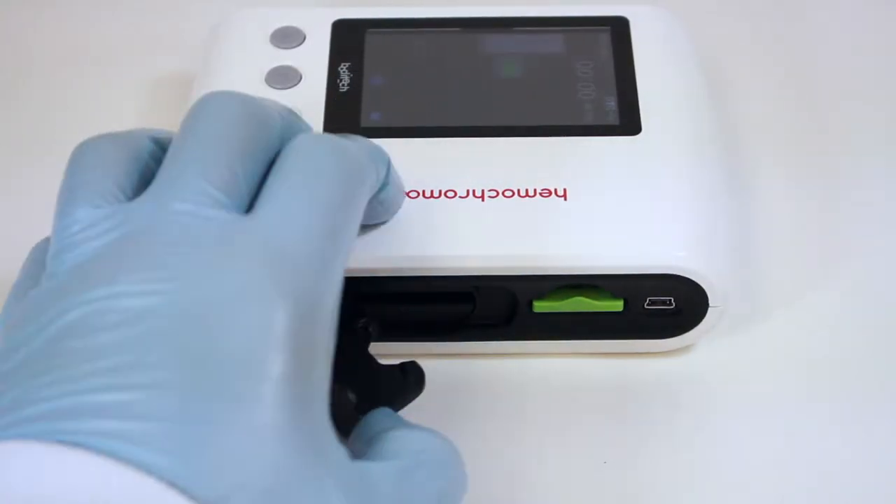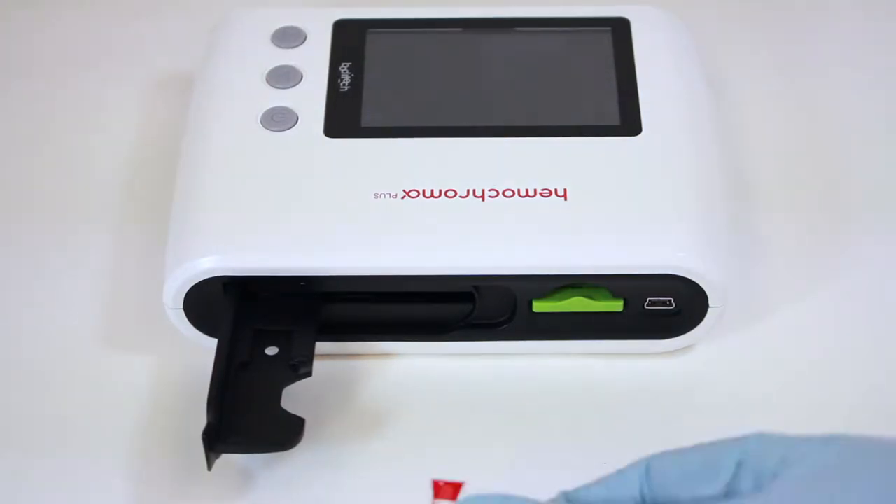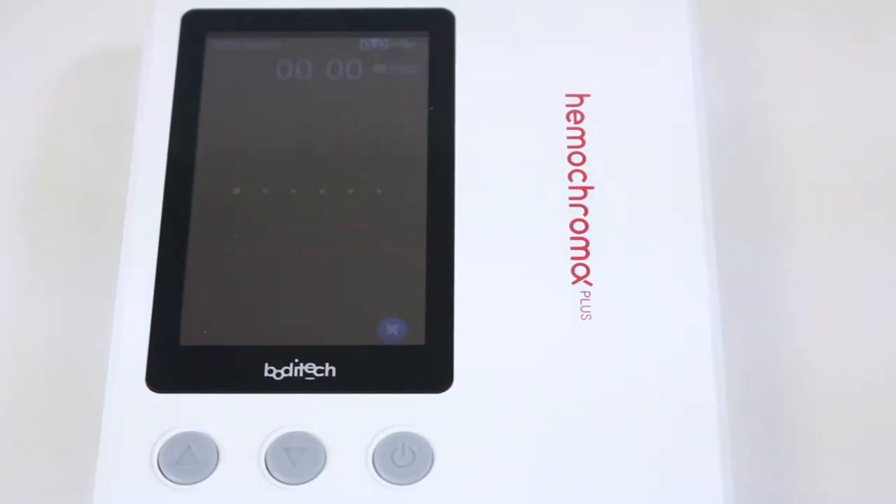With a finger, open the microcubit holder located on the right side. Insert a sample loaded microcubit in the holder and close the holder completely. A beep tone sounds and the test proceeds automatically.